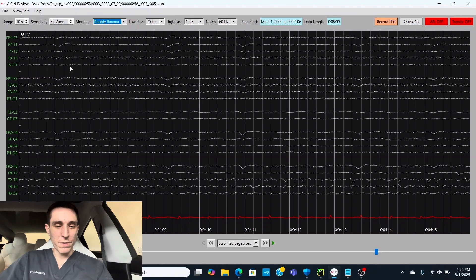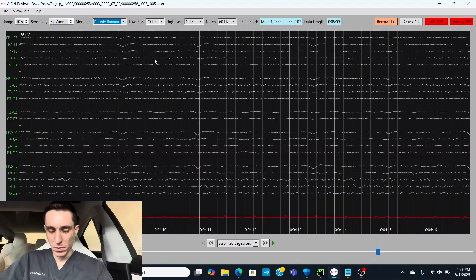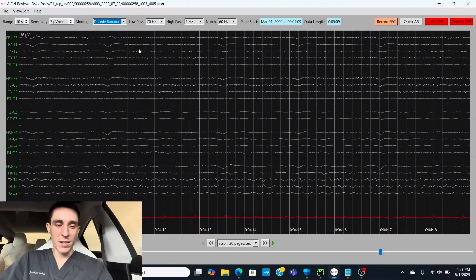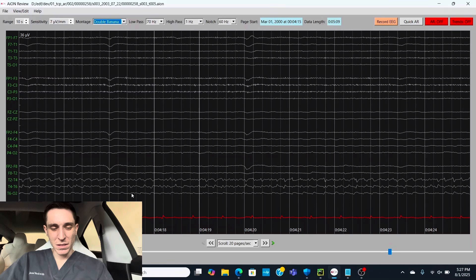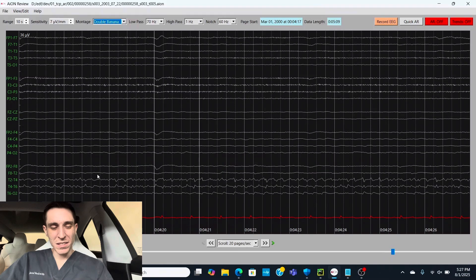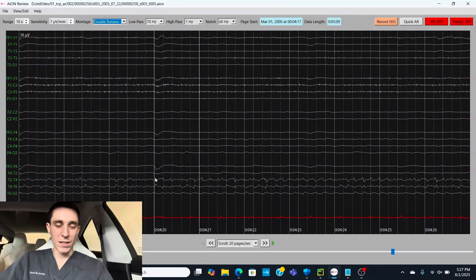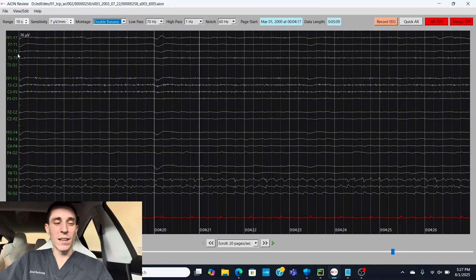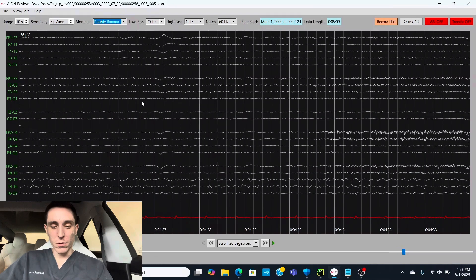And if we compare it to the left temporal region, it's essentially low amplitude, flat. And we have a little bit of muscle noise superimposed on the brain activity. And you can tell this looks definitely different than this right here. So it's good to compare both the right hemisphere, in this case where the patient has their tumor, this is why this is probably the most important place to look for seizure onset in this patient specifically, and compare it to the left temporal region.